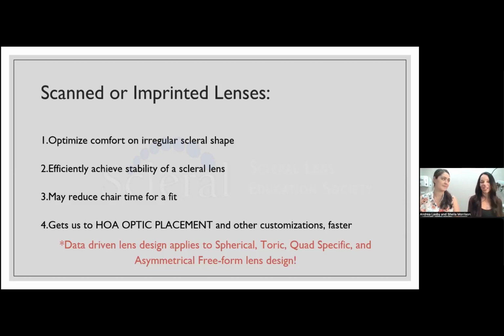Actually, in some cases, we're almost too much of a glove fit, which is where you have to pay attention: are we fitting too perfectly, where there's no tear exchange and they're too hard to get off? And that's some of the things that we face with our freeform designs today, which we mediate with things like fenestrations and purposely putting a channel in here and there, or lifting an edge or something like that.